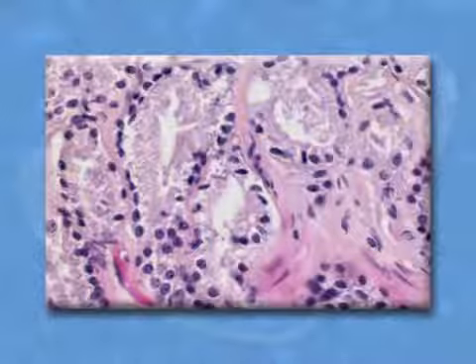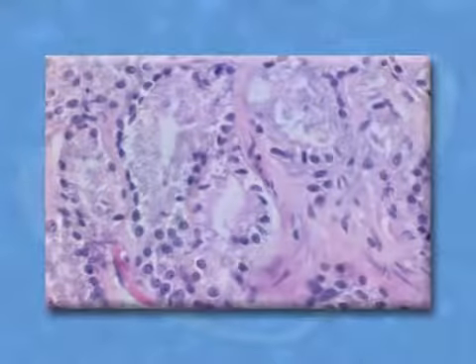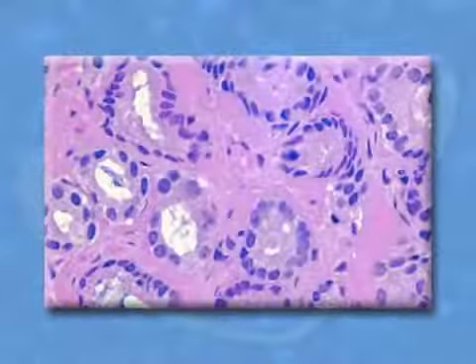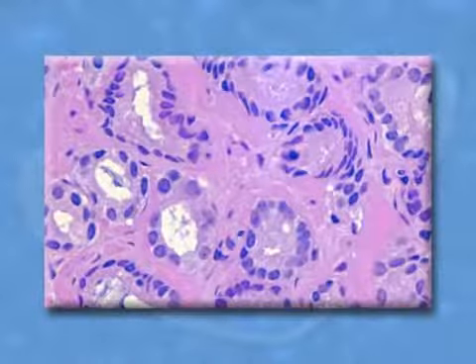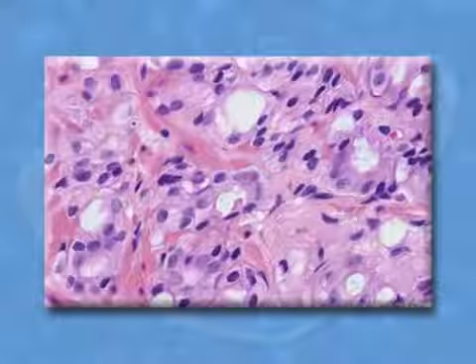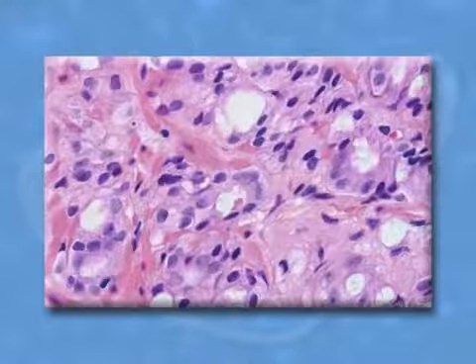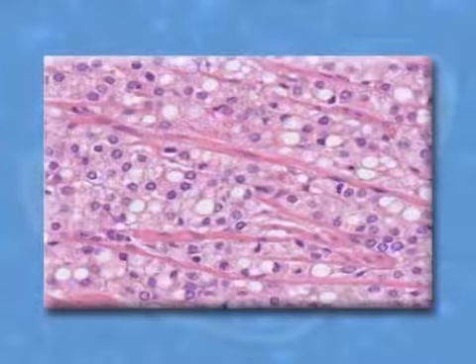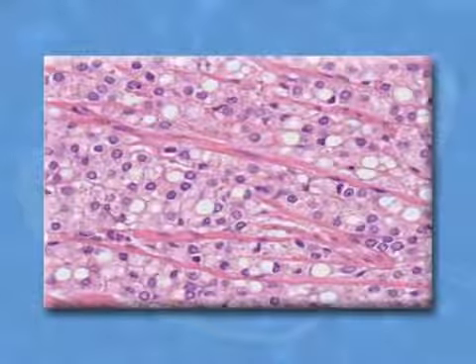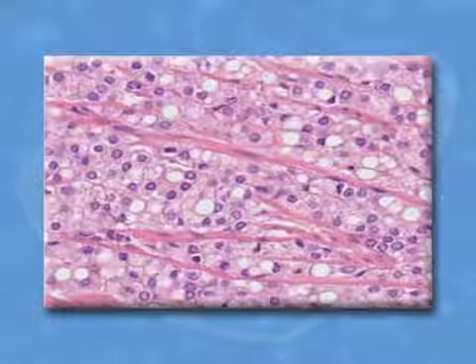A Gleason 3 pattern, which is the most common malignancy seen, appears like this under the microscope. In a Gleason 4 cancer, there is marked abnormality in terms of the structure and architecture of the cells and glands under the microscope. And the Gleason 5 pattern has the most pronounced abnormalities noted under the microscope.